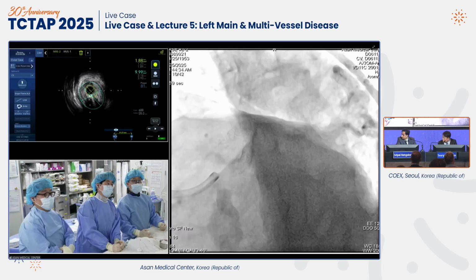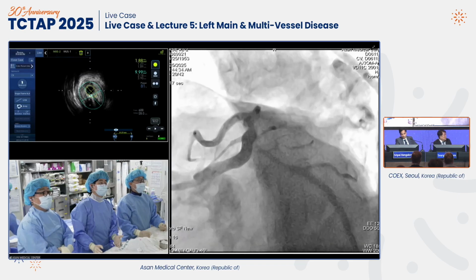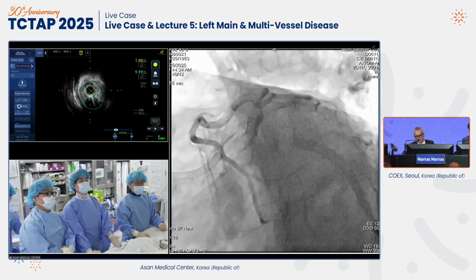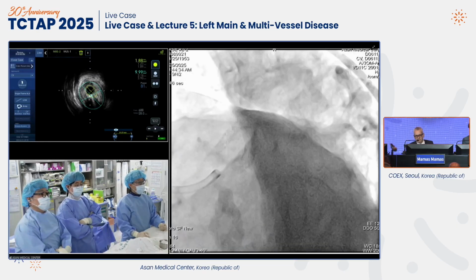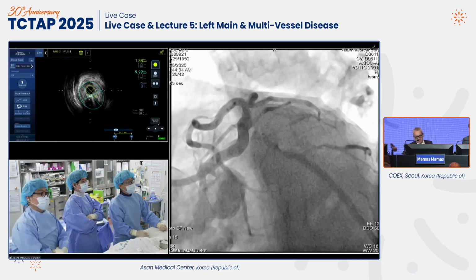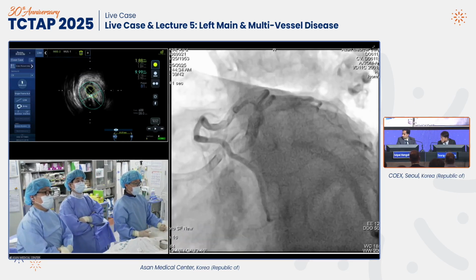You see, I would probably go with a cutting balloon and then use a DCB, and see what your result is like. If the result is acceptable, I would stop there. If the result isn't great, then I would probably consider the T with TAP approach here. I wouldn't personally be doing Culotte into this and adding 2 layers of stents. I agree with you, Mamas. The same.